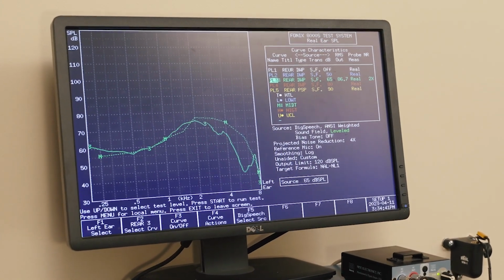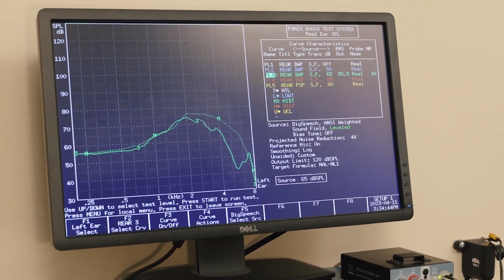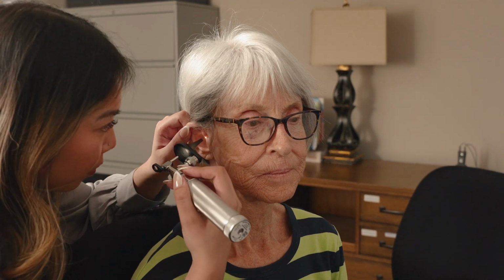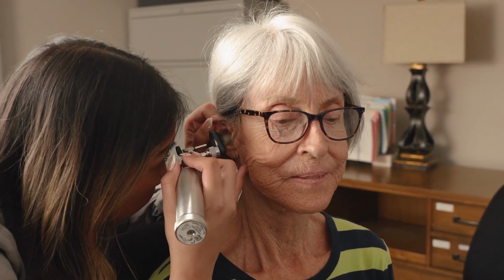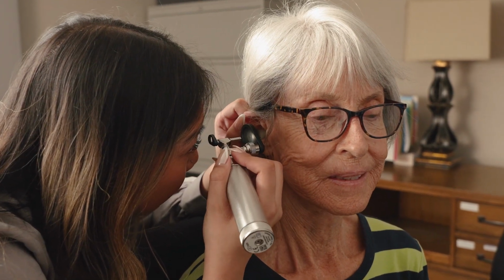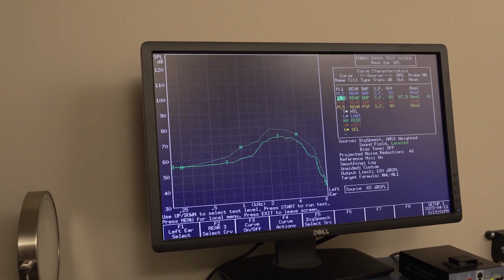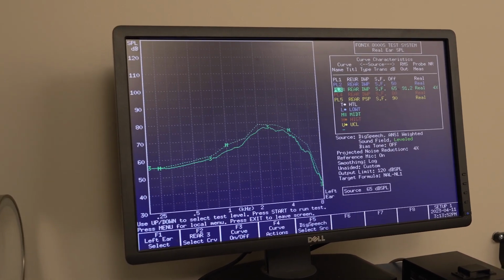However, what initially comes out of the hearing aid, or what we call the first fit, is rarely what is needed by the patient. Each ear canal has its own acoustic environment. The canal has its own size or volume, and physical properties such as skin, bone, fat, and cartilage can be different as well. Our goal is to program the hearing aid, which is the solid line, to match the dotted line, which is the prescriptive target.